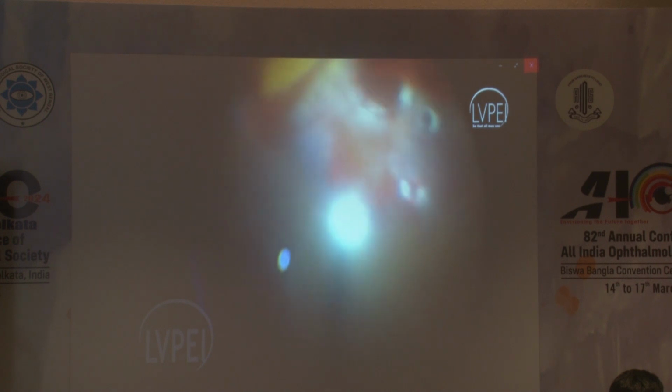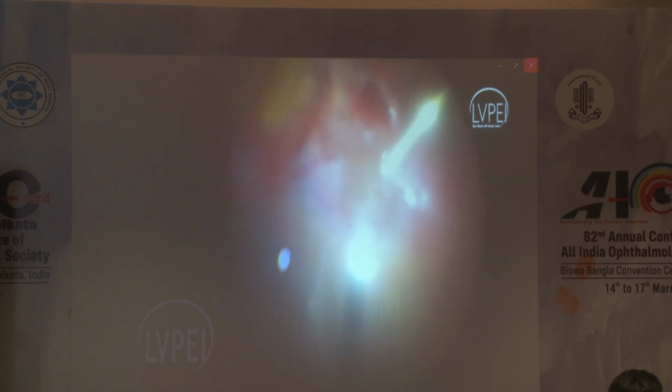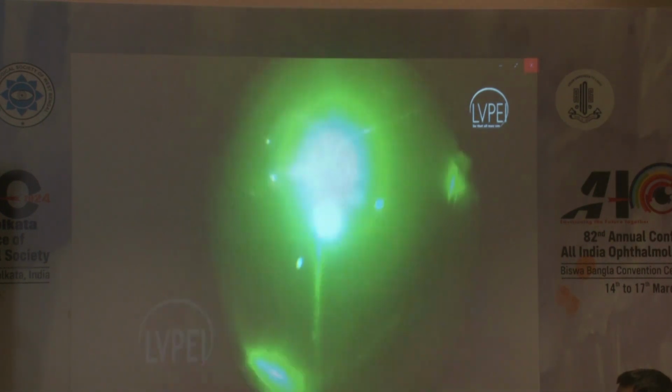After this, ILM was peeled with ILM peeling forceps after staining with brilliant blue dye. Large subretinal blood clots were aspirated from the site of the break, which was converted into a retinotomy for efficient clot removal. Endolaser was done around the breaks, followed by panretinal photocoagulation.